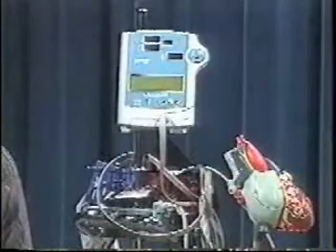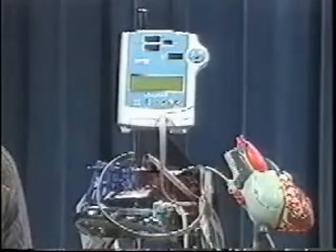Behind me I have a relatively new type of blood pressure apparatus. This is called an electronic blood pressure apparatus. It has a digital readout. It's used now in more and more facilities. It's considered to be very accurate and takes some of the guesswork out of blood pressure determination. It does not require the use of a stethoscope. It does have a cuff that's placed around the individual's arm, and it registers the reading on the digital display.